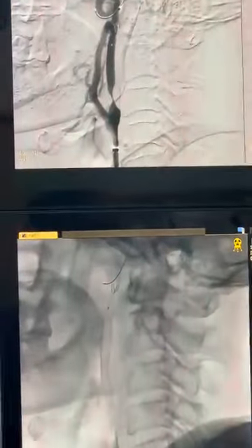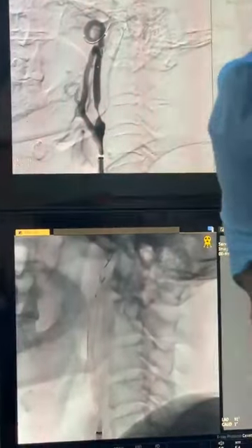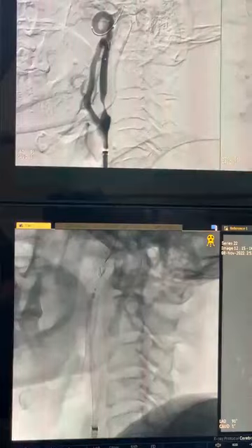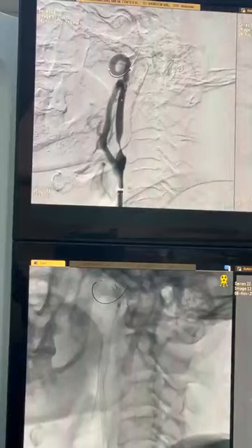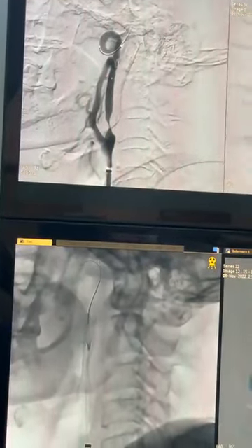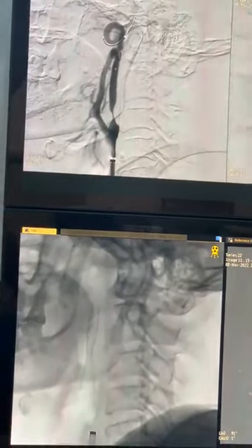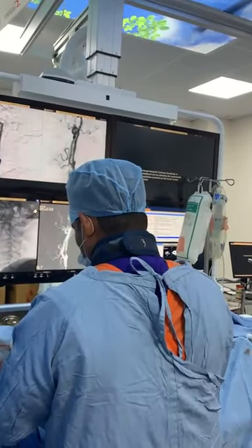So capturing the filter is a very important step. You should ensure that the filter is a sufficient distance away from the stent, otherwise the filter can be caught in the stent, which will again be difficult. And you can do a partial capture of the filter. So you made it look very easy, sir. Now, have there been any incidents of failure to retrieve the embolic protection device? So what does one do, sir? Surgery will be required.